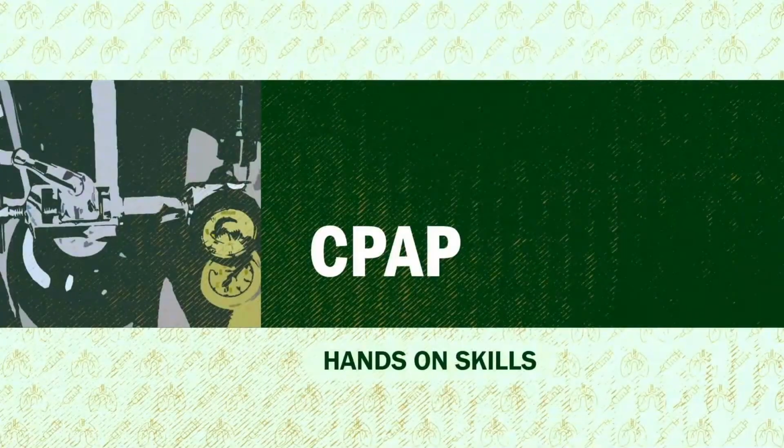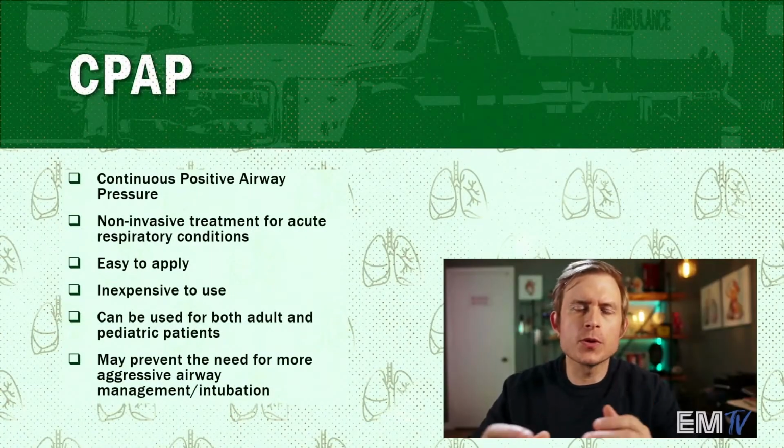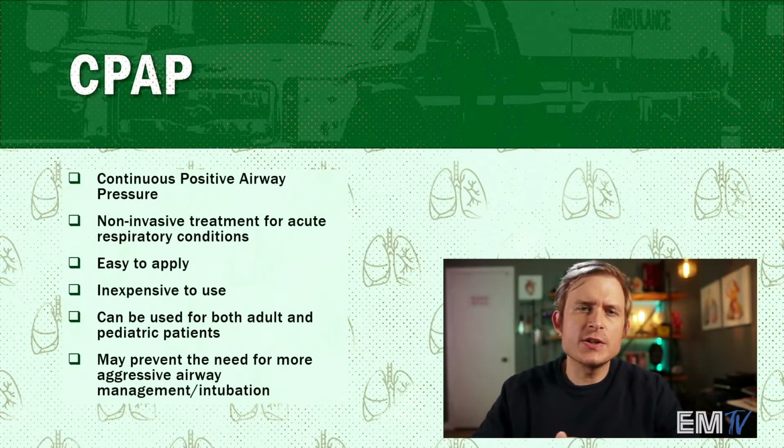My name's Alex Like, and today we're going to be talking about CPAP. You've probably heard the term CPAP used before. CPAP stands for Continuous Positive Airway Pressure.